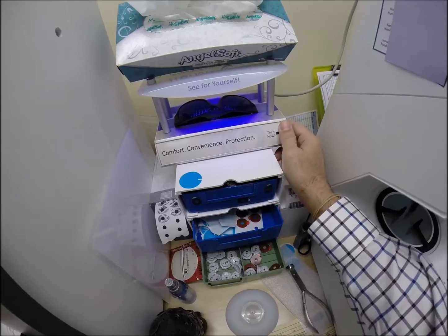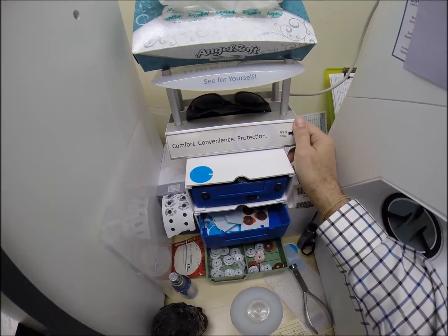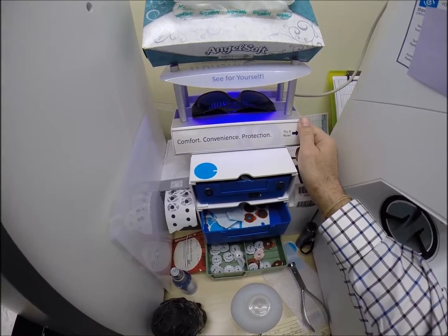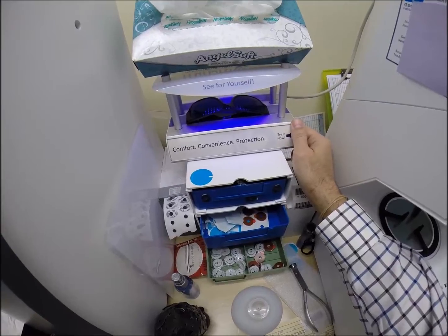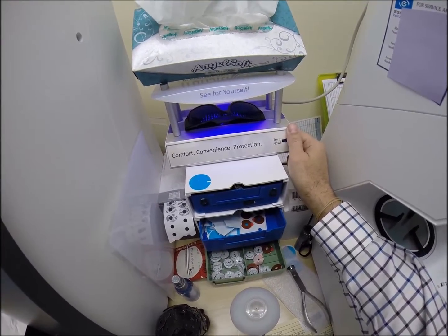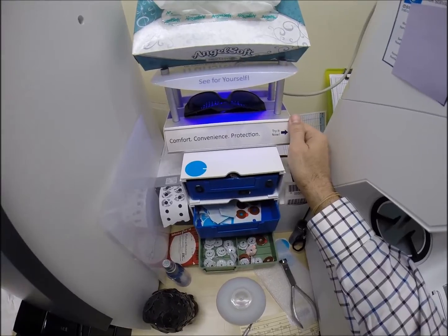The only time they won't work is if you're behind the windshield of a car. Your windshield absorbs all the sun's harmful ultraviolet rays, so your dashboard doesn't crack from sitting in the sun. Now, having said that, these are Transitions XTRAactive. The Signature 7 will not darken in a car. These will get 30 to 50% dark behind the windshield. Now, Signature 7 are also temperature sensitive, meaning they'll get darker when it's 85 and below than they will when it's 95 and above.